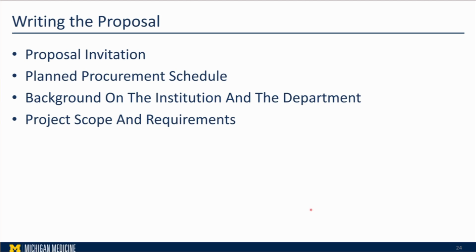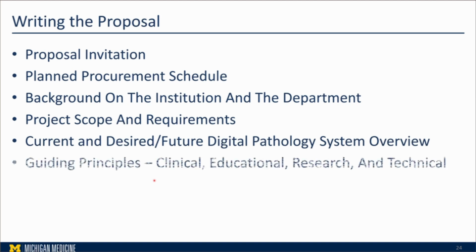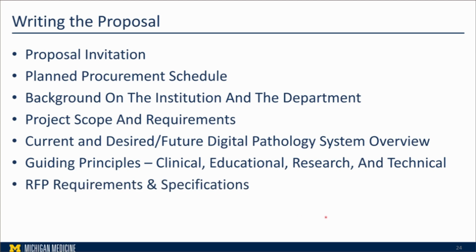So it depends. The other thing is the current and desired future pathology system, which we also put in the proposal. We gave some clinical, educational, research, and technical principles on our vision. We also gave the requirements and specifications, which were handled by the procurement team, and we provided all the support documents that those vendors need.